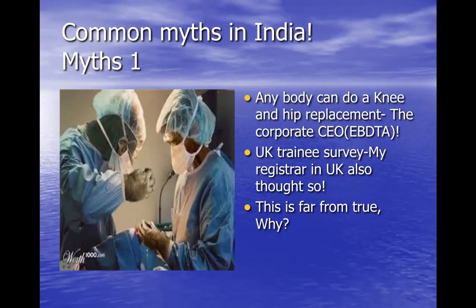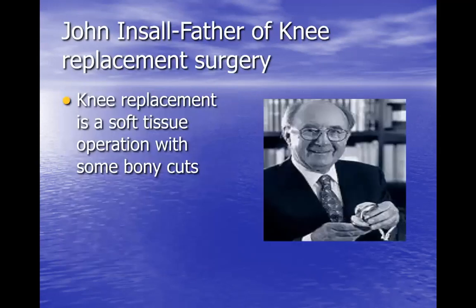Even in the UK, my trainees, my registrars felt the same. And they all said, Mr. Srikanth, what's so big a deal about knee replacement? Just open the knee, put the jigs, cut the bone, fashion an implant, close it up, finished. Bob's your uncle, as they say in the UK. So these two concepts are far from true, and I'll explain why they're far from true.